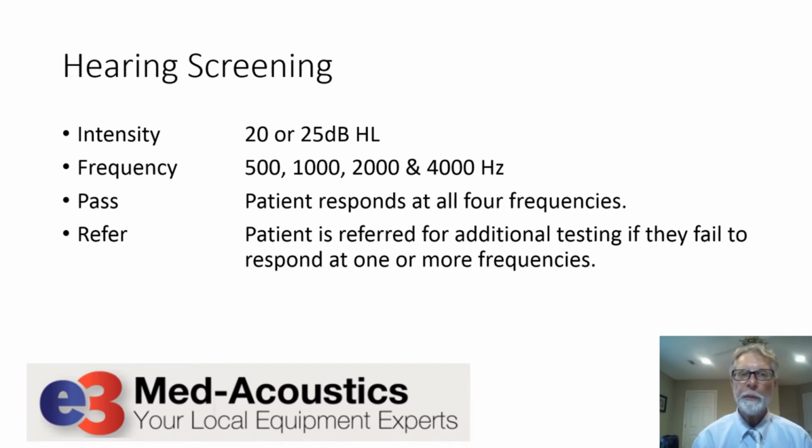When you do this, you would set the intensity at a particular level. And it's either going to be 20 or 25, whatever is your clinical standard, and usually the physician or whoever's in charge, supervisor, will make that decision. If you had a very quiet place or a sound booth to do it in, this is a booth, a room, it's usually a metal room, could be all kinds of different sizes, but it's meant for hearing, designed and installed there for hearing testing specifically. All right, well then you certainly can do it at 20. If not, then 25 is what I would recommend.